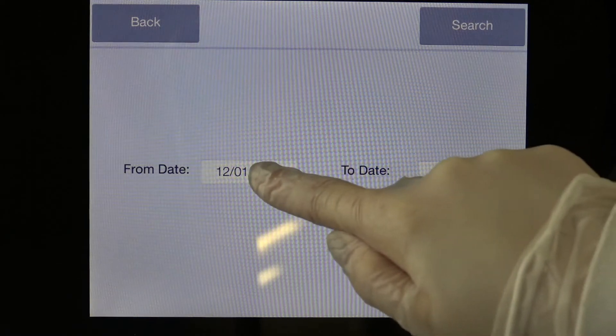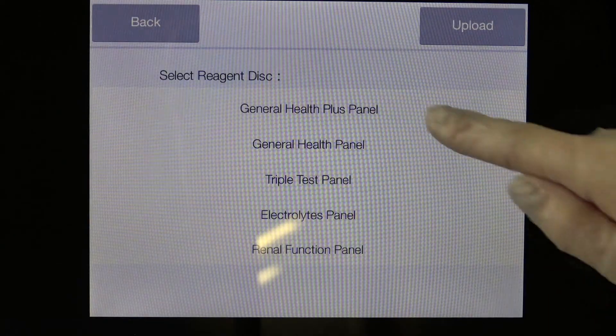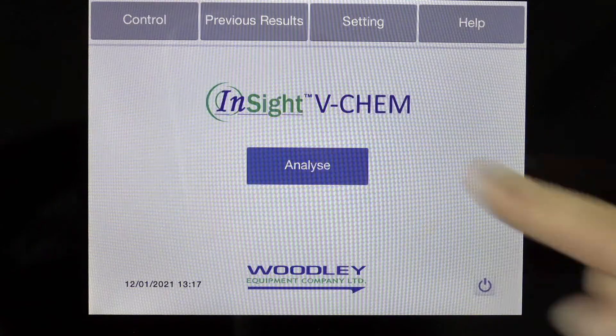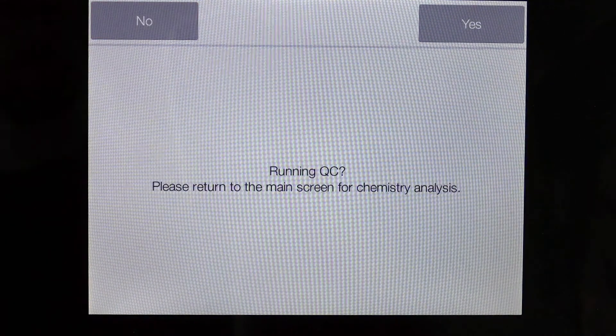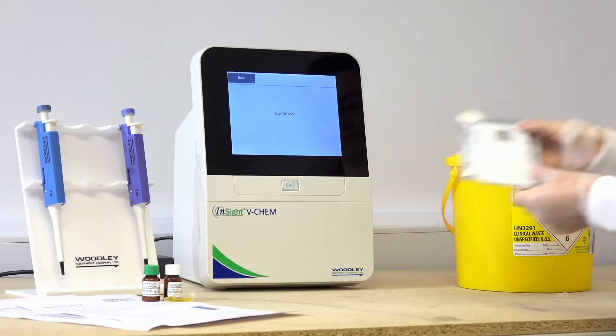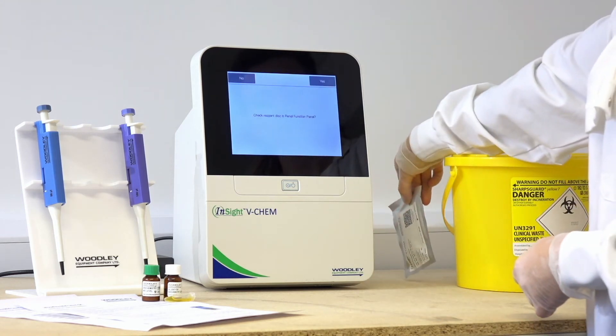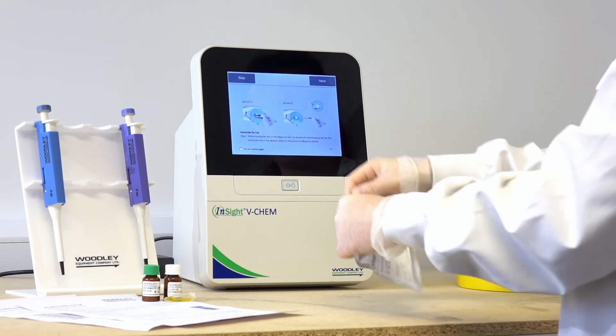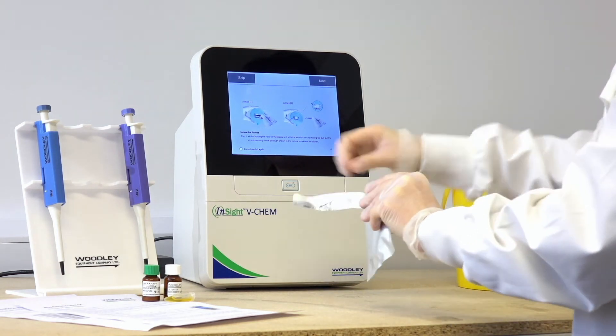Control results can be searched for by date, and then by rotor type and QC lot number. To run quality control on the Insight VChem, prepare the QC material as advised by Woodley Equipment Company on the QC data sheet supplied with the QC material. Select Control from the main screen. Select Yes to confirm a QC is to be tested. Scan the QR code from the foil pack of the rotor to be used. Press Yes to confirm the rotor type.